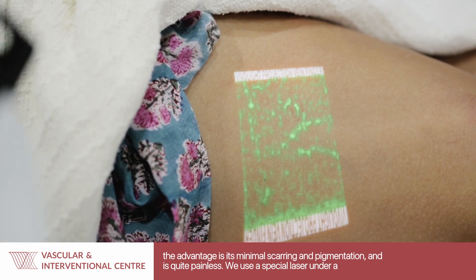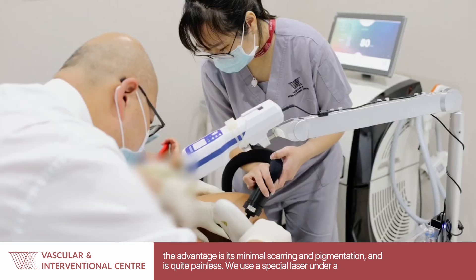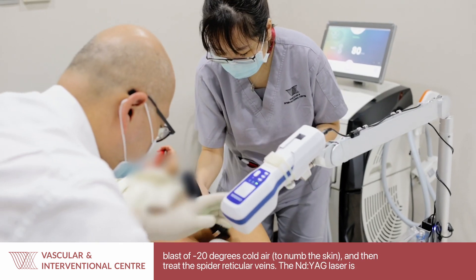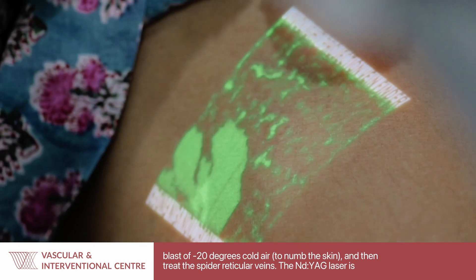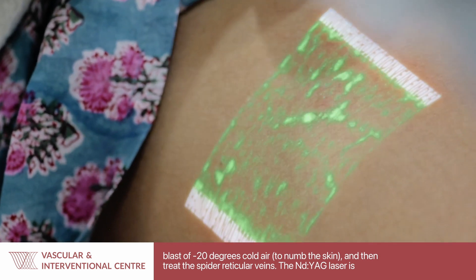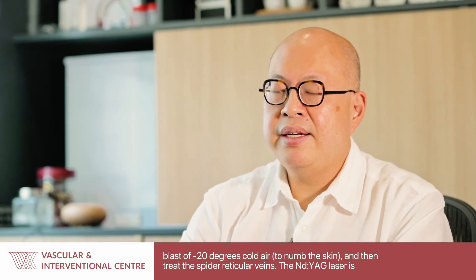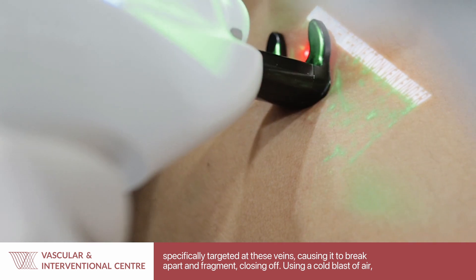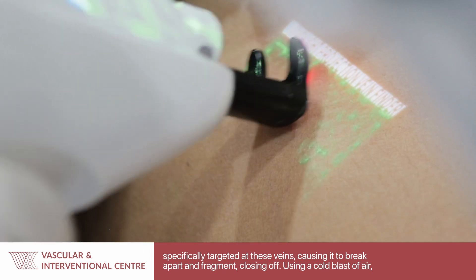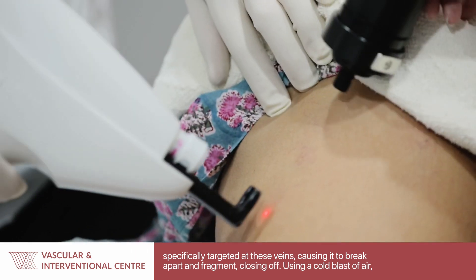We use a special laser and under a blast of cold air of minus 20 degrees we numb the skin, and then we use the laser to treat the spider reticular veins. The laser, particularly an Nd:YAG laser, is targeted specifically at these veins, causing them to break apart and fragment and then close off.